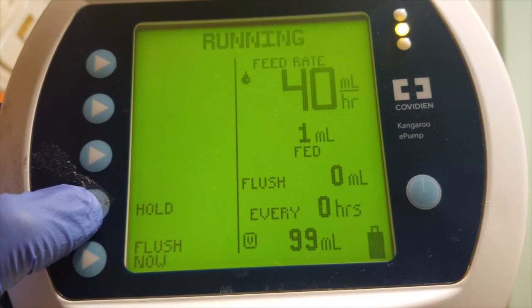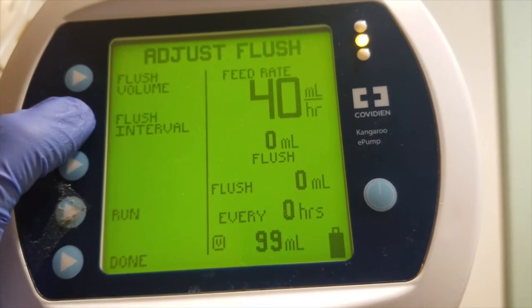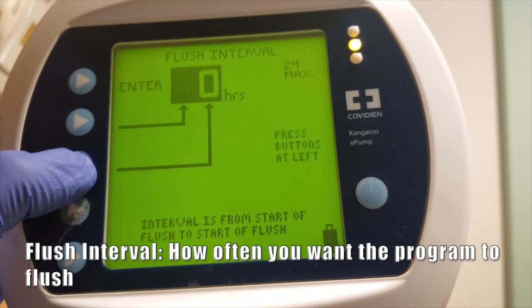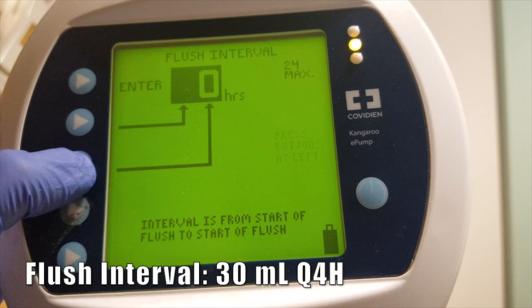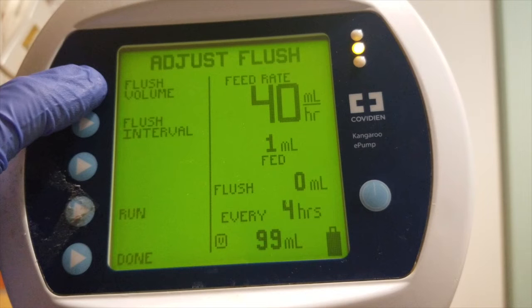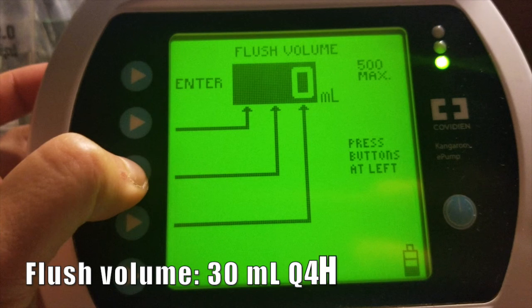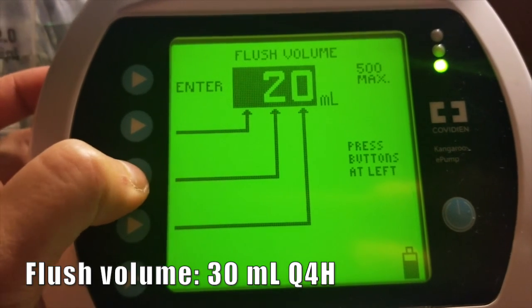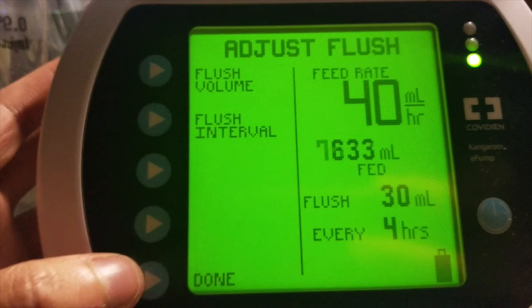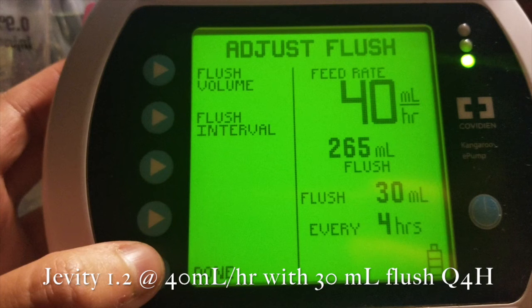Let's program flushing now. The steps are exactly the same. Press hold, adjust settings, adjust flush, then flush interval. Flush interval is how often you want the program to flush. Our order is every 4 hours, so let's put that in. Enter. Now press flush volume — this is the amount of mls we want the program to flush every 4 hours. The order is 30 mls, so let's put that in. Enter. Before we press done programming, I like to do a last check with the doctor's order: Jevity 1.2 at 40 mls per hour with 30 ml flush every 4 hours.